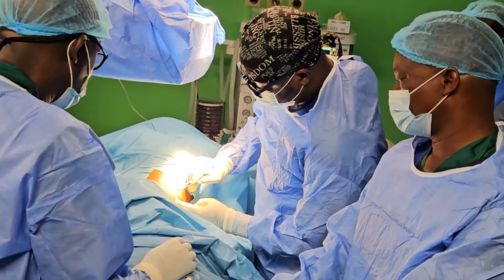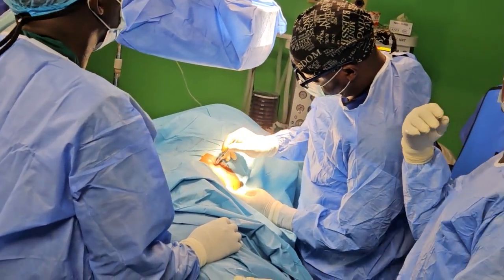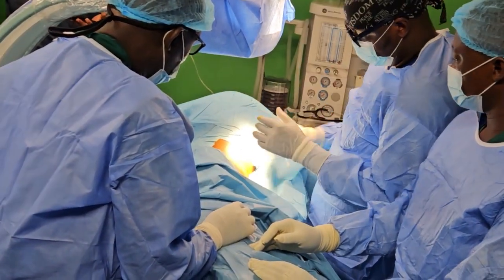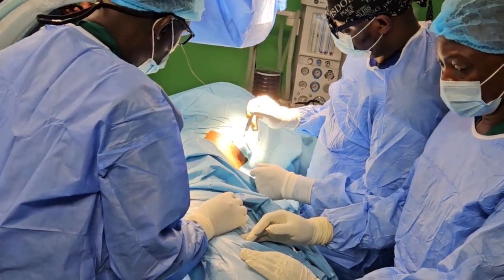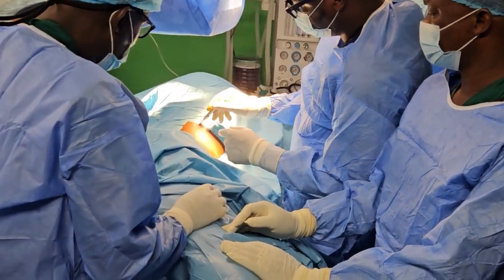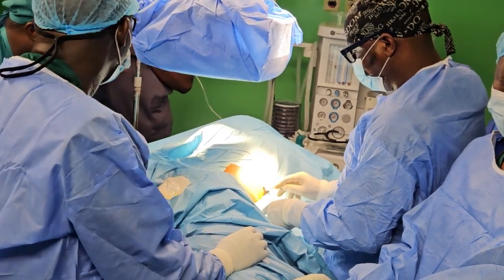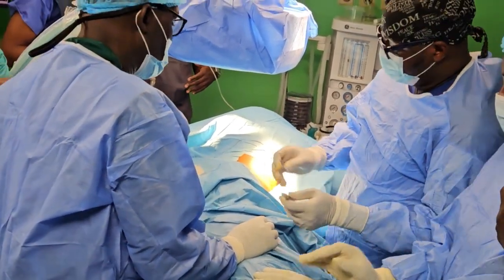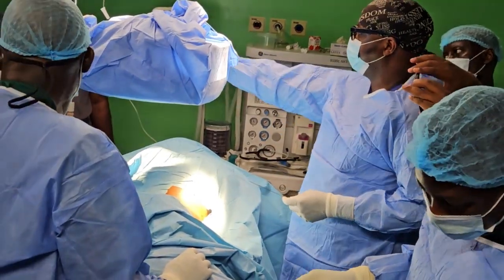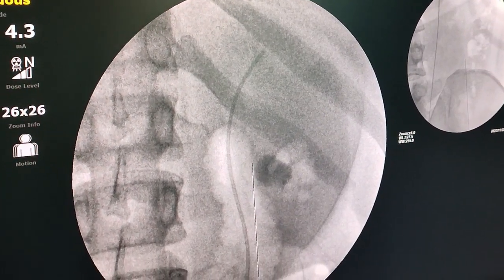Can you see the marker on the skin? We can't see. See if you can. It's on now. Here is dark. Can somebody take a picture of this with the phone and put it on the WhatsApp? Take a picture of the mark on the skin. Maybe she lost it again. Not yet. He has to take a plain shot for me. Perfect. You're a great man.